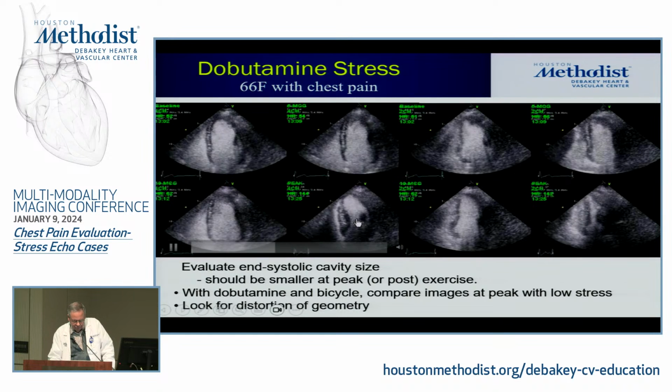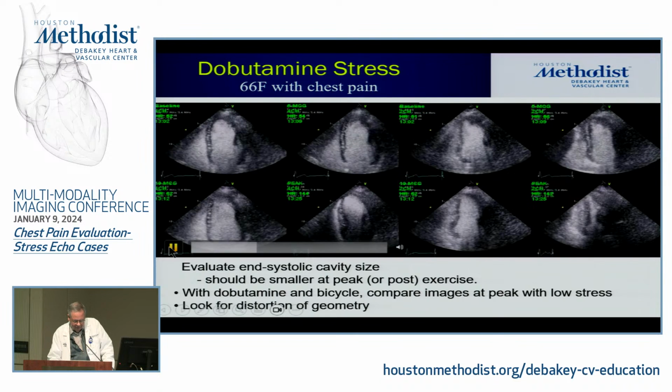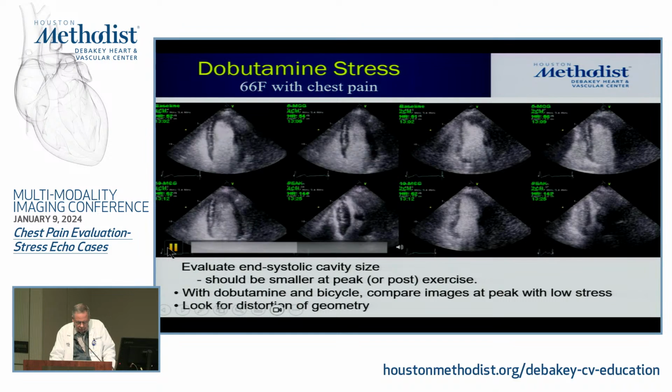Look right here. Now. There. Okay. Here you have, I think I was lucky. Got it. Here you have this end-systolic diameter right here. Okay. Versus right here. In addition, remember, there's also distortion of geometry. This is the geometry here, where here, look at the geometry.